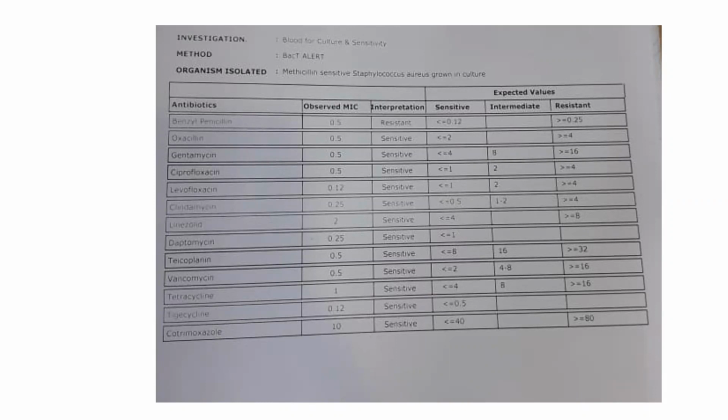So the report we were just discussing, the values and the different antibiotics and the different MIC values, is calculated and analyzed by the machine. That is what we call the Vitek machine. There are different types of automated sensitivity tests like Vitek, or Beckman Coulter, and other companies that come up with different automated drug sensitivity tests. So this is a type of automated sensitivity test. BacT/Alert is a type of bottle, and then there are different types of sensitivity cards that they run with the machine.